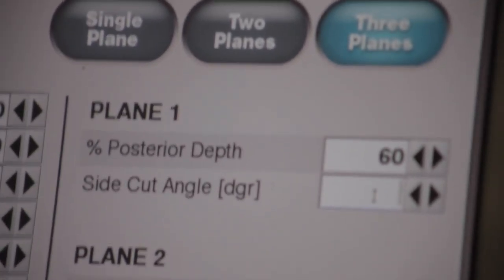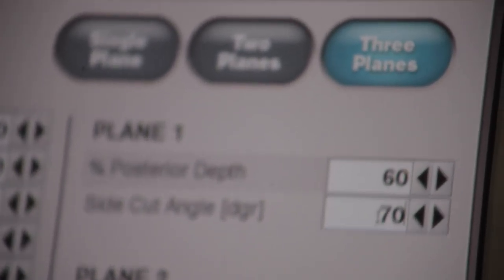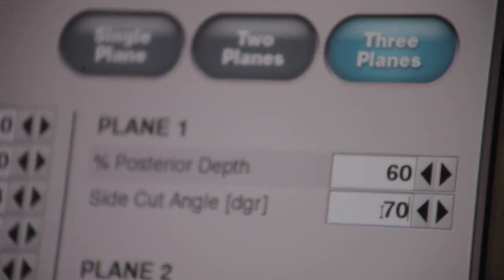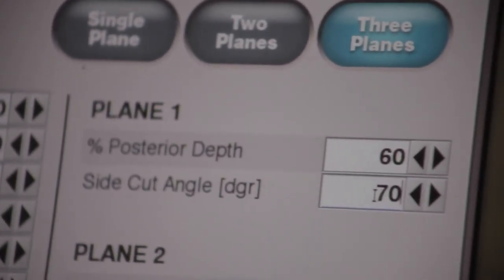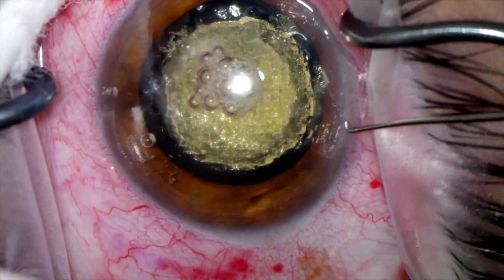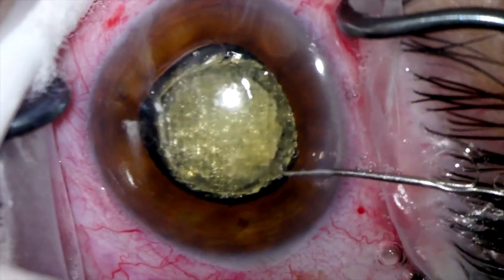The following challenge is to place this incision as close as possible to the limbus. By giving a 70 degree inclination to the plane, the laser can be applied within transparent tissue. Only a very small portion would be affected by any opaque tissue, thus making opening of the incision easier and more effective.